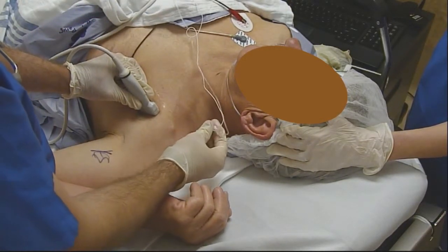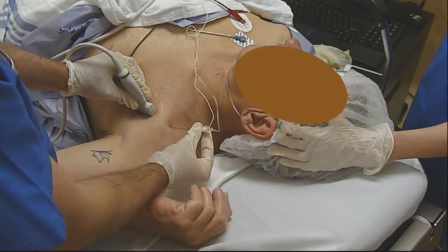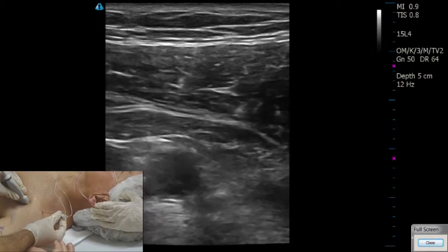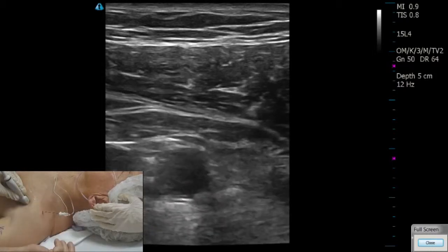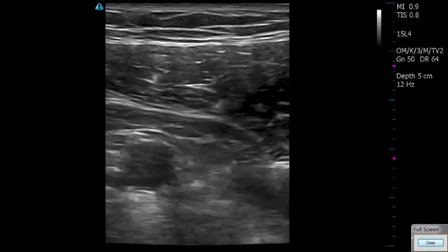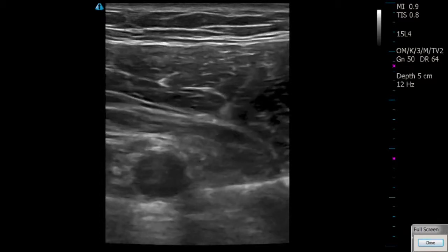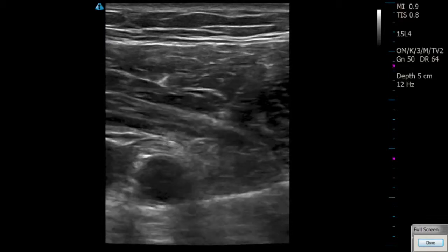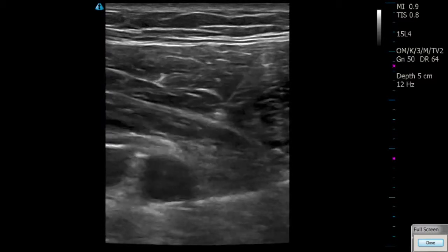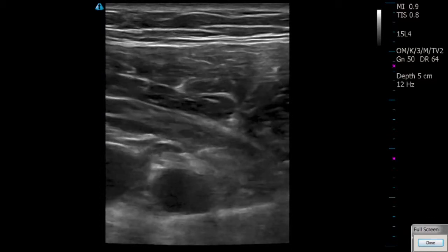Now we'll be inserting a 22-gauge 8-centimeter stimulating echogenic needle from Pajunk through that same infiltrated track, at about 45 degrees to the skin. I'm inserting from the right side of the screen to the left. To enhance visualization, we'll switch to a full-screen ultrasound image — you can see a very nice echogenic needle coming in from right to left. Our ultrasound stimulator is set at 0.53 milliamps to use a dual guidance technique of ultrasound visualization and nerve stimulation. We want to get just under that six o'clock position with the needle.